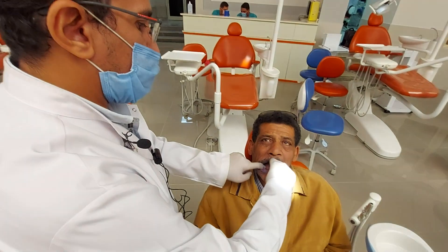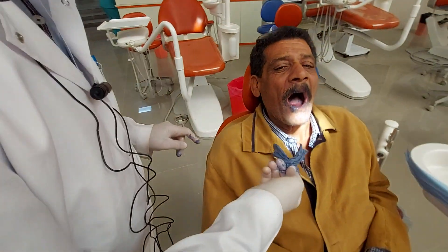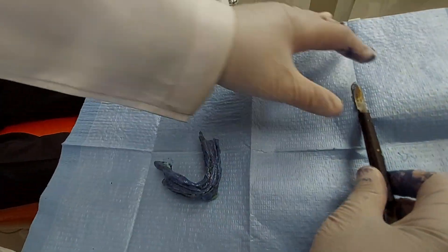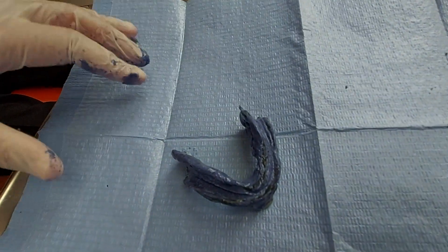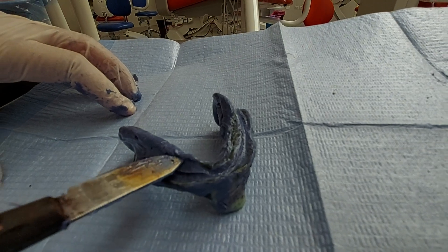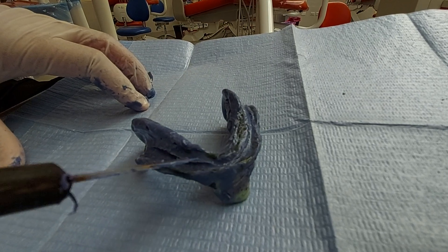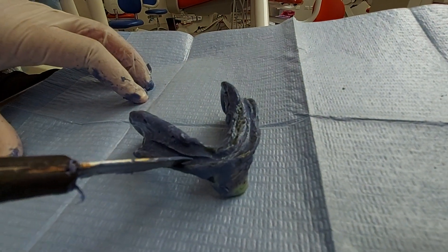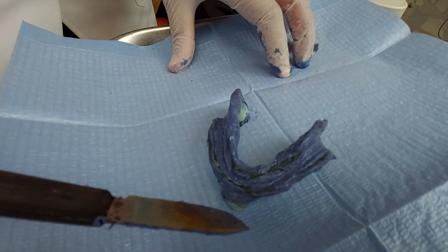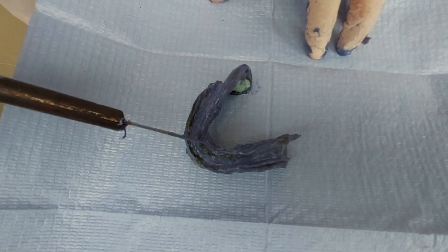When the material sets, you hold the handle, break the air seal, and remove the impression slowly. As you see, the impression is recorded — you can see the lingual parts on both sides, the lingual and alveolingual sulcus, lingual frenum, and the labial border. However, there are pressure areas present in the labial part and at the lingual frenum. This means I have to relieve those areas and retake the impression.